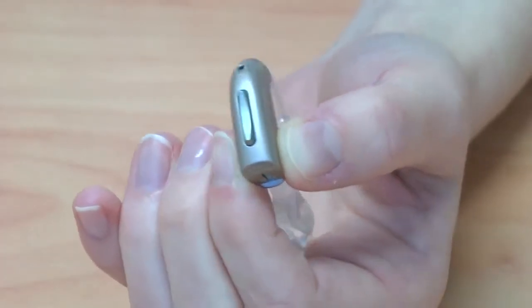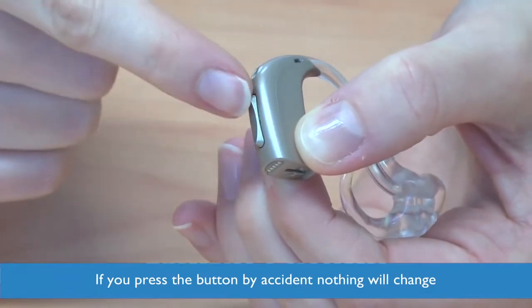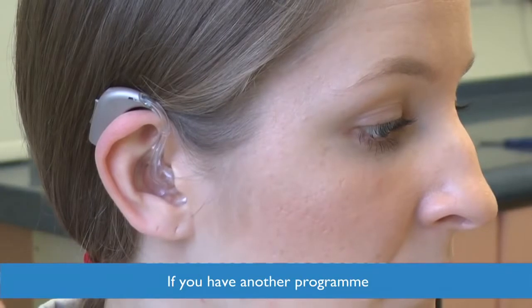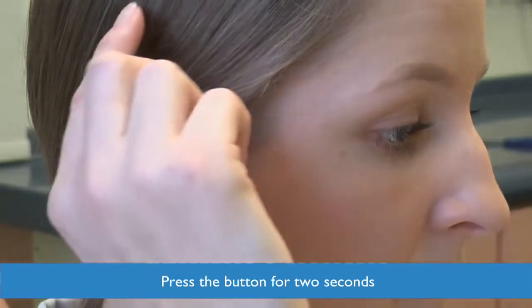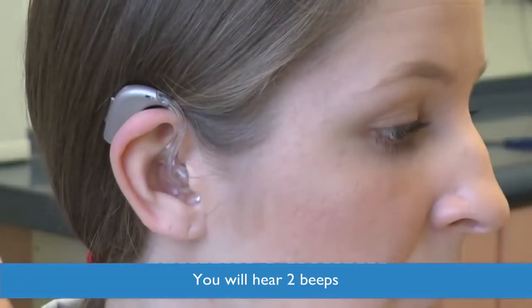Don't worry if you don't have any additional settings. It won't matter if you press the button by accident, as nothing will change. If you have an additional program, just press the top button for exactly 2 seconds. 1, 2. And you will hear 2 beeps.